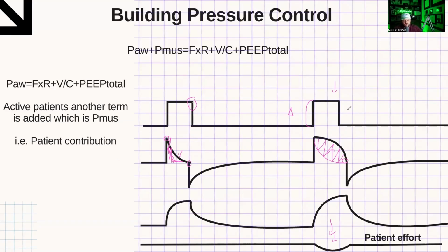And here, you might be able to start to think about, what is that? If I drew my alveolar curve, right? Is it going to end here? No, because there's still flow. Is it going to end here? No, because they got more volume, i.e. more pressure than this other breath on the left. So it's going to end somewhere up here, not that we can see, but sort of theoretical.